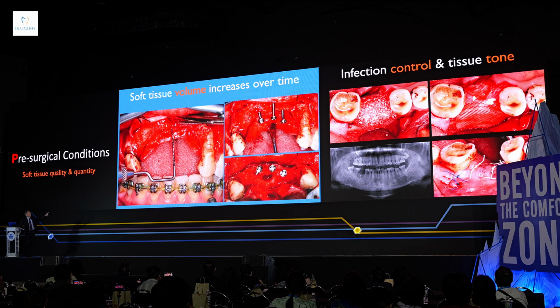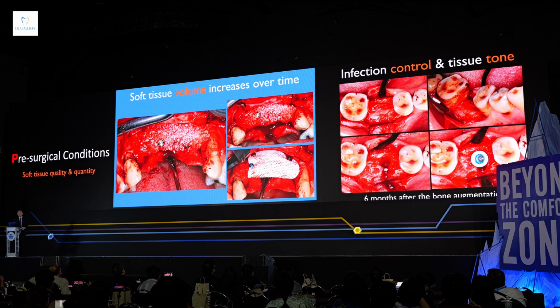And the middle one, after I had enough soft tissue, that's when I could do the vertical augmentation. If you look at the defect, it's a vertical bony defect, completely missing the buccal and lingual plate, with more than 10 millimeters of bone loss. I placed 3 tenting screws and removed the incisive nerve bundle. For the other one, on the extraction site, I placed the bone graft and a resorbable membrane.